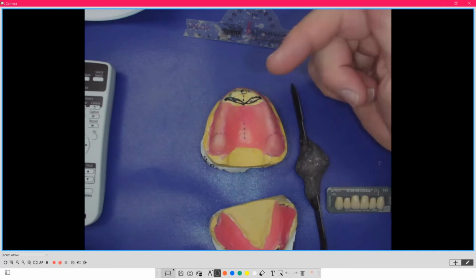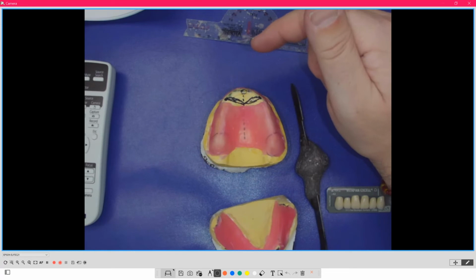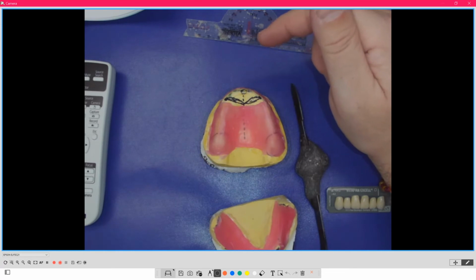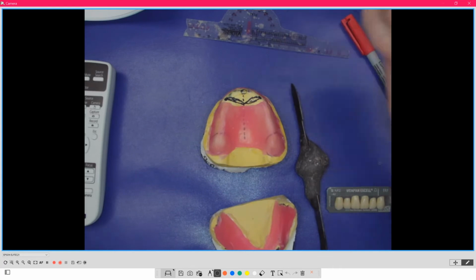The reason why you would ever want to do 9 is that if the patient is demanding a little bit more support and denture support, we can go up to 9 without it looking like Bucky Beaver, because you're just ahead of the wet and dry line of the lip, but it's enough that it can help with that support of the upper lip, and especially the red of the lip, and pushing out the red portion of the lip. So it's a nice little trick.